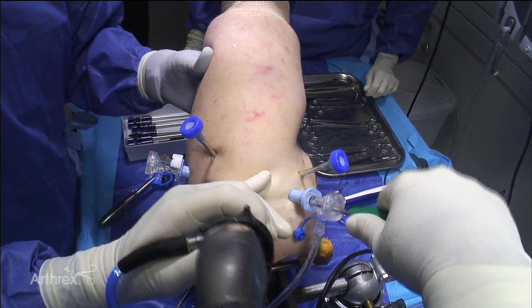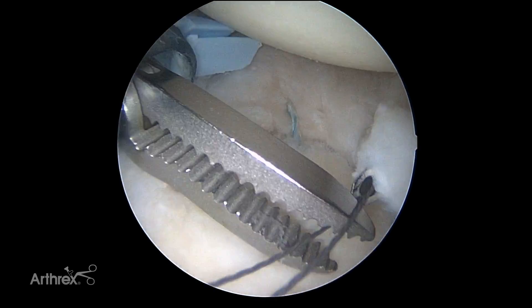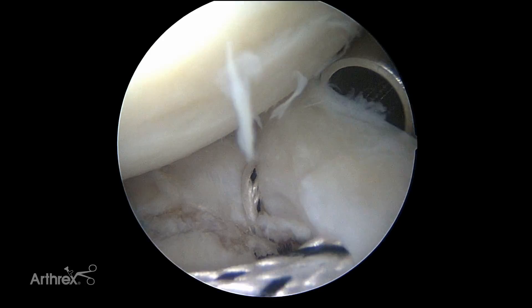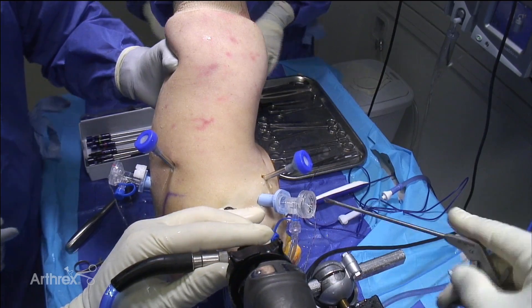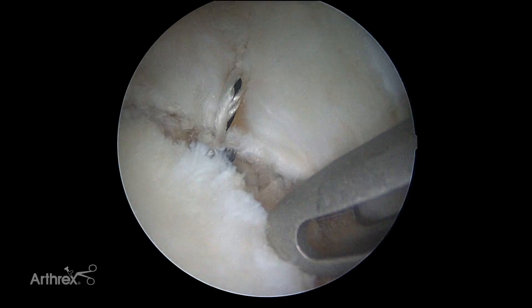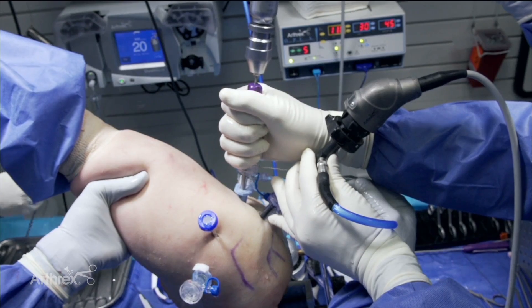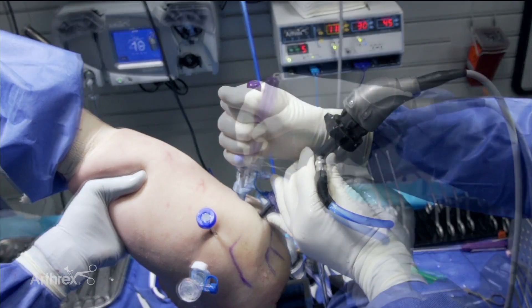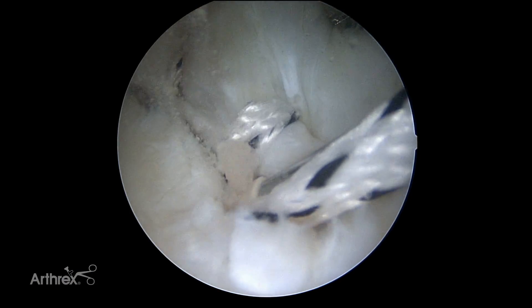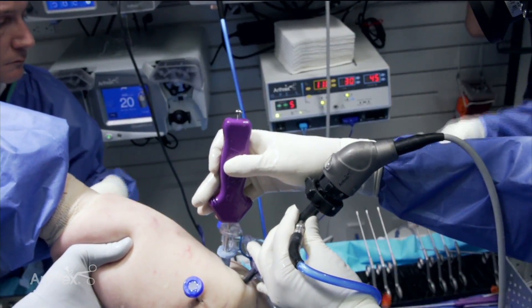Now we'll pass our labral tape. For an anterior lesion you're generally going to want three anchors — for demonstration purposes I'll show two today, recognizing there would have been one above. Keep a little tension in that tape while we drill. If you need to lever the humeral head, you'd want to use a suture tack instead of the push lock, because with the push lock you don't have a spear to lever with, and you can end up breaking the anchor if you depend on levering against the humeral head. That's an important precaution to be aware of.